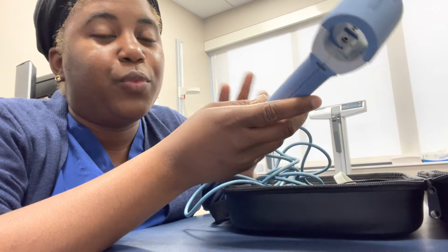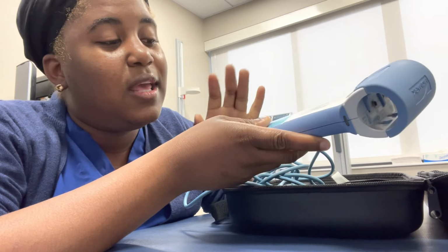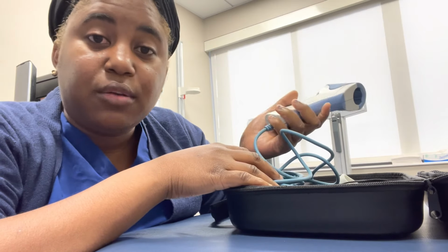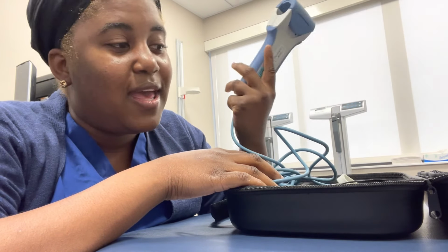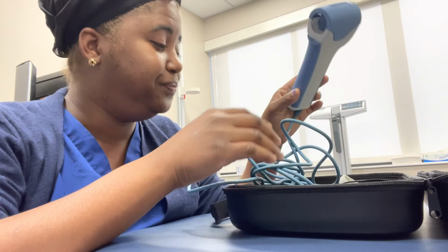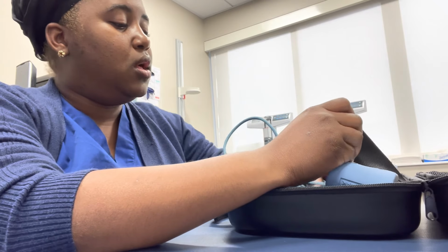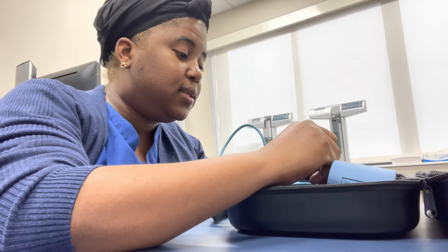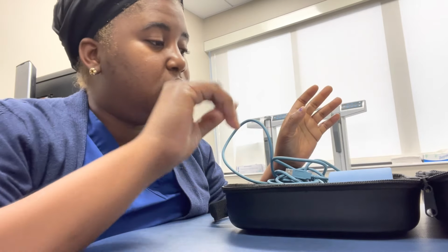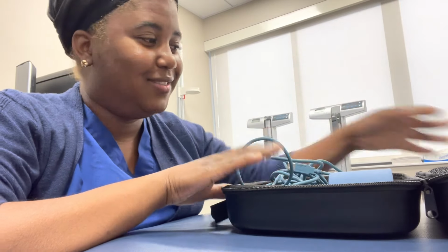And then we print the report out, because it's 3 times. We print the report out and then give it to the doctor to read. And then we scan the report in their chart. And yeah, that's the spirometry for you. So that's how it's done, you guys. It's nothing difficult. It's the same software as the EKG. So, yeah.